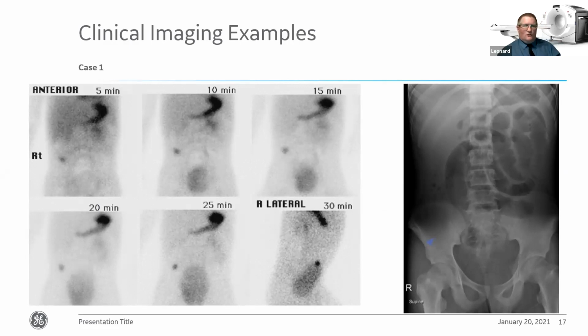So we undertake what we call a Meckel scan, and that's where we can inject into the body itself, and it'll pick up any areas where you might have a strange appearance of mucosa within the actual colon itself. So we're looking at the small bowel here. Sorry, I lost my mouse then. So what we're looking at particularly is the small bowel. Up here we have the stomach, coming round and going through into the duodenum and then running through the rest of the ileum and everything else. And at the distal end of the ileum, you've got this increased uptake here within the patient. And this is sat right within the right iliac fossa where the patient's complaining of pain.